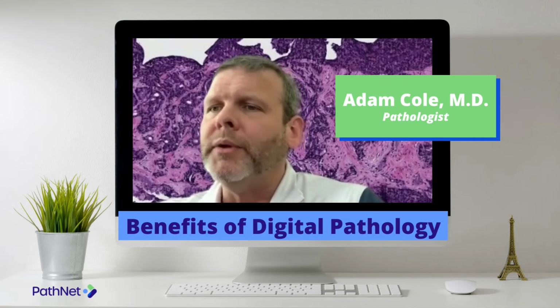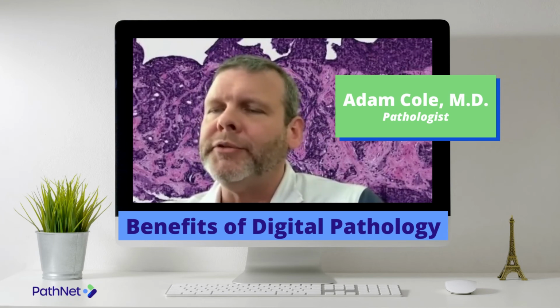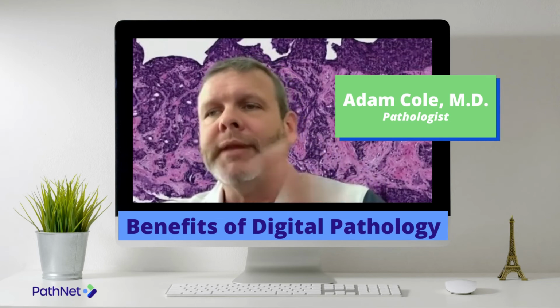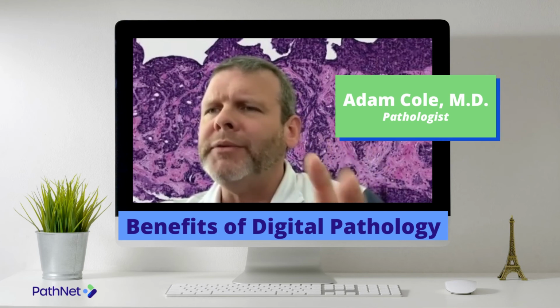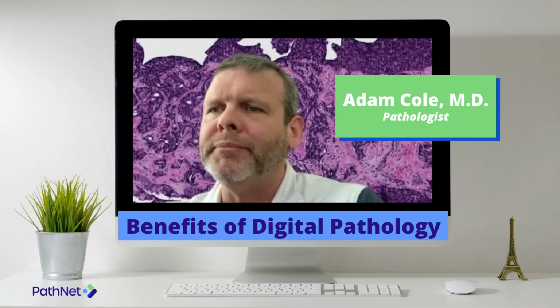The image quality, we're obviously CAP validated. We validate everything we look at with a microscope just to make sure. But the image quality now on these iPads rivals anything as far as a microscope goes. So I have yet to encounter the case, granted, I'm looking at genitourinary, prostate, and bladder, where I've looked at something and said, "Man, I sure wish I had a glass slide and a microscope here, so I could really get down on this thing and throw oil on it or something."